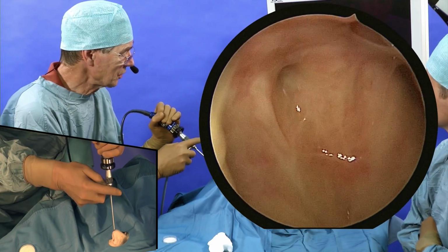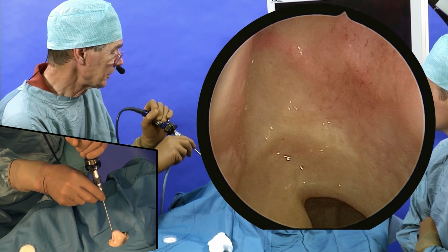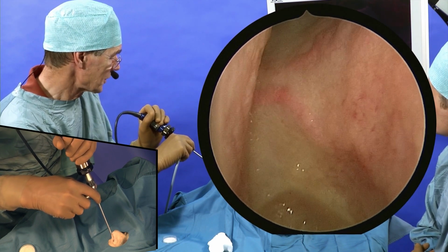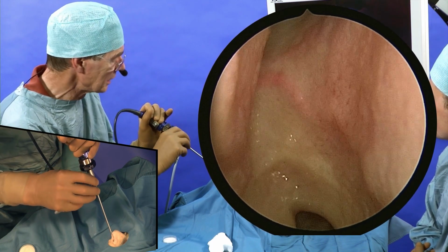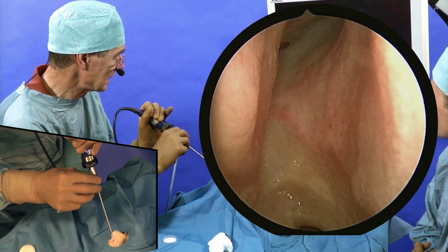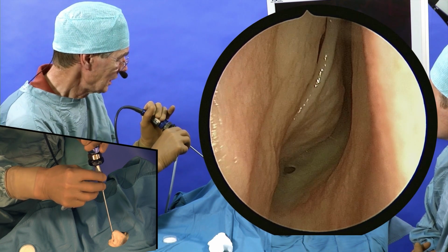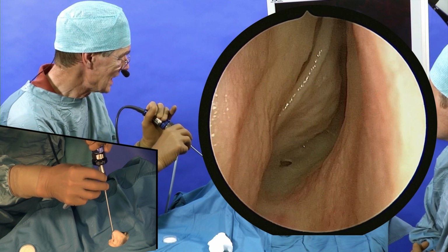Now, let's try to bring this up, the choana going a bit anteriorly, and I try to go up into the sphenoethmoidal recess. Here you have the vessels, or branches, of the sphenopalatine. We see the sphenoid sinus ostium, but let's stay down there and let's assume that I couldn't bring my telescope up. So now I start again to tilt up, and you can see 20 degrees, 25, 30, 45 degrees, without a movement of the telescope. It's just by rotating the lens in the tip.